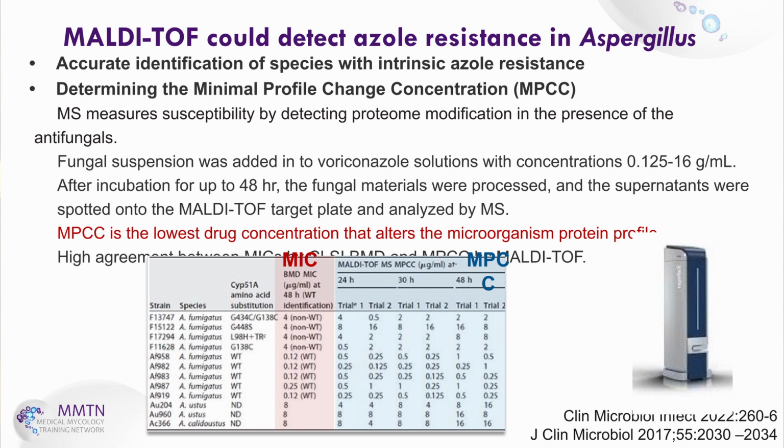MPCC is defined as the lowest drug concentration that alters the microorganism protein profile, so we can get an MPCC value. The study results demonstrate a high agreement between the MIC determined by the CLSI broth microdilution method and the MPCC by MALDI-TOF. So this proof-of-concept study suggests that MALDI-TOF has the potential to detect azole resistance in Aspergillus.